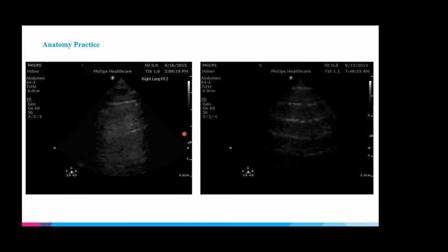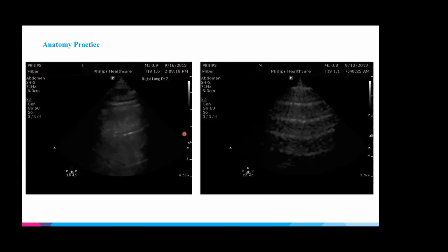All right, so then with this, I have two clips here. So what do we see over here? A lines. Okay, and why do we say A lines? Horizontal lines. Yeah. You see this is the pleura right up here, and then these are the parallel reflections. You see one pretty clearly here, right? And then I'd have to sort of imagine something here, but I think I see a second A line down here.